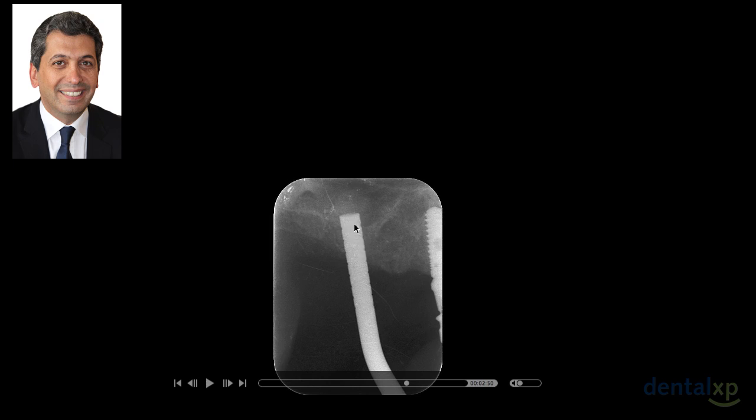You see that now that I'm more confident and I know that I started elevating, I can insert my osteotome inside the sinus. It's going 2 millimeters into the sinus. And you can see here, and this is very important to see, this convex shape of the biomaterial that went into the sinus but is still enclosed by the Schneiderian membrane. So when I look at this radiograph, I am sure that my graft procedure is going the right way.